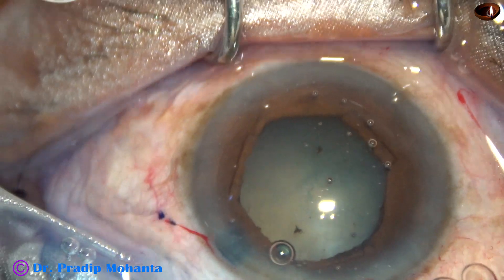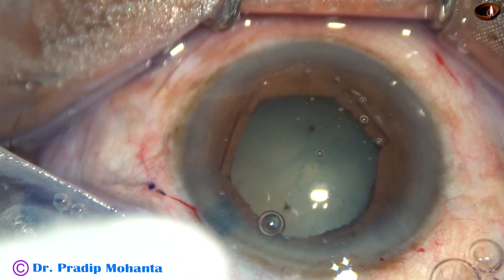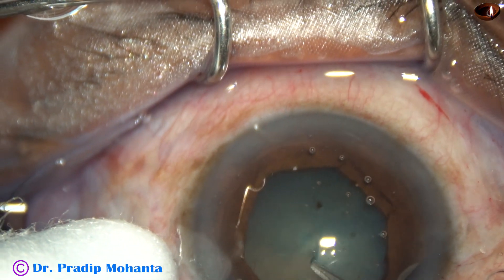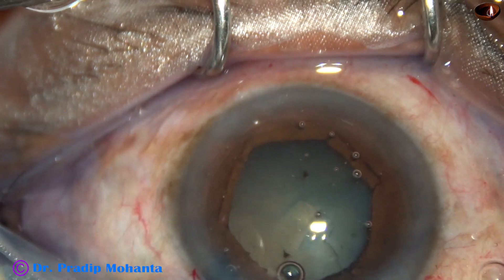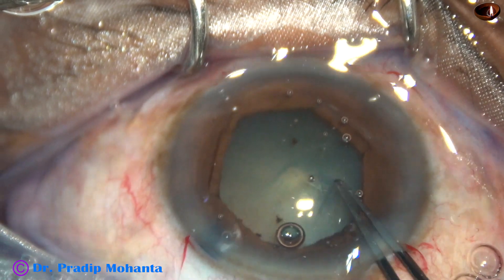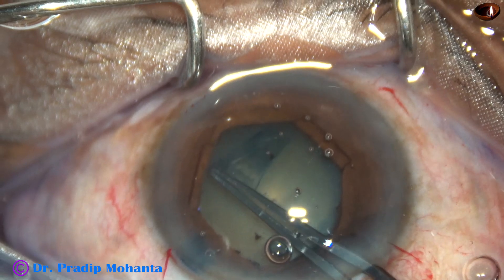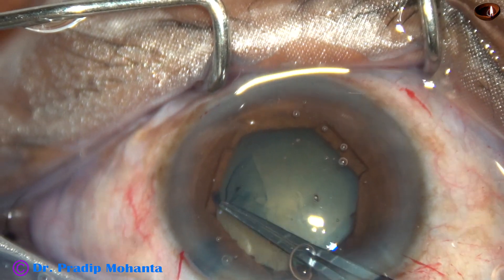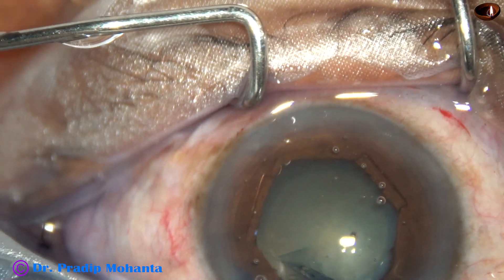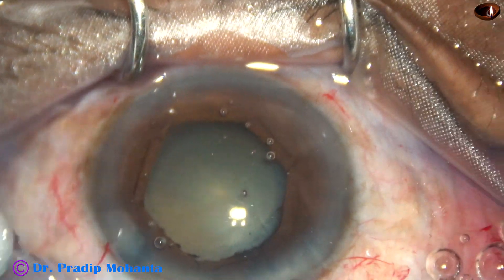And now is the time to do capsulorhexis. I am going to use a 26-gauge needle, bent. I have incised the capsule, raised the capsular tag, holding the capsular tag with the utrata forceps, going anti-clockwise around the margin of the hexagonal pupil, and getting an adequate size of about 5 mm.